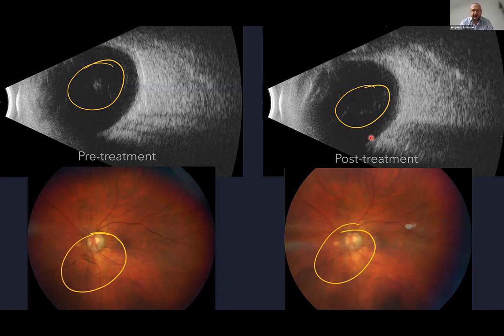And I've got a patient here that I've done ultrasound on, and I also did color fundus photography. We can see the floater pre-treatment, and post-treatment, the fundus photograph shows the improvement a lot more.